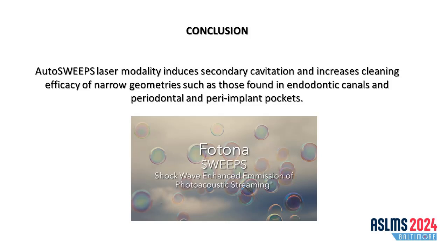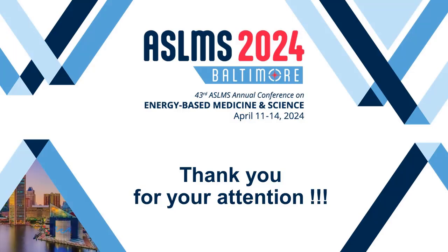So using sweeps, photoacoustic activation helps to remove biofilm even at large distances from the fiber tip. So this is really important in endodontic canals, but also in periodontal pockets. And that's my conclusion, actually. So thank you very much.